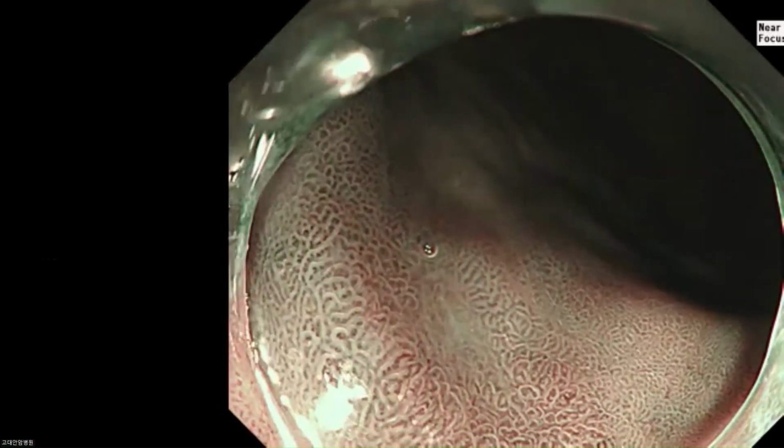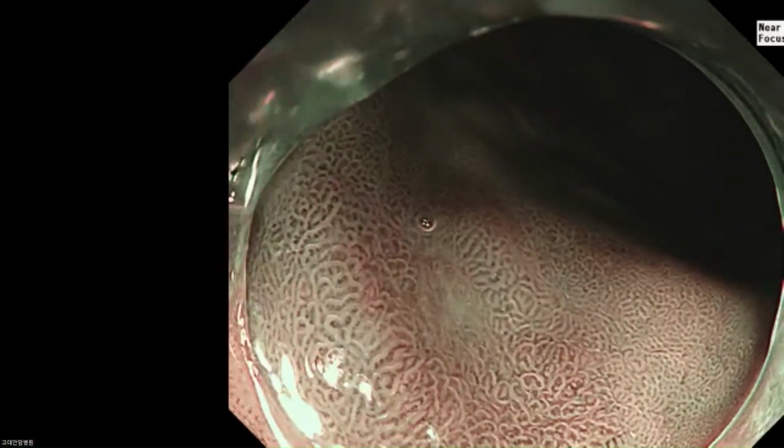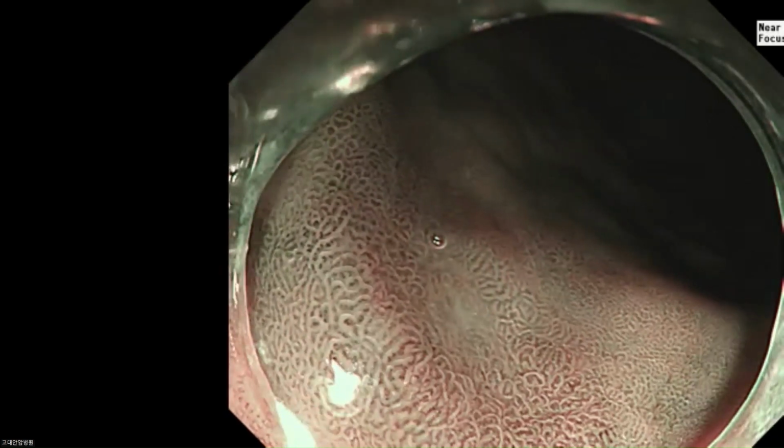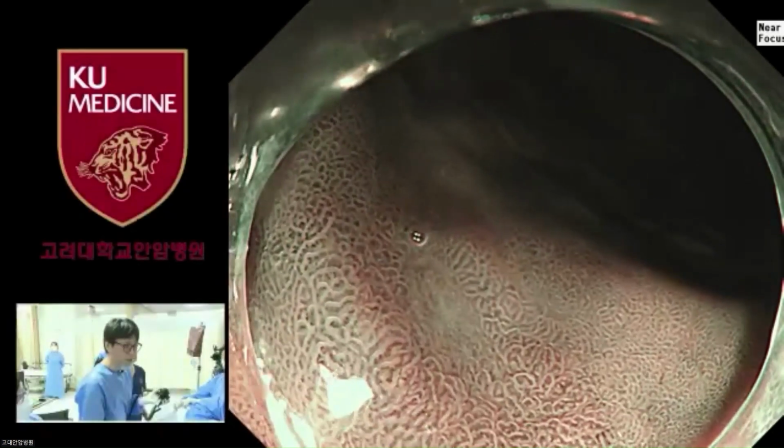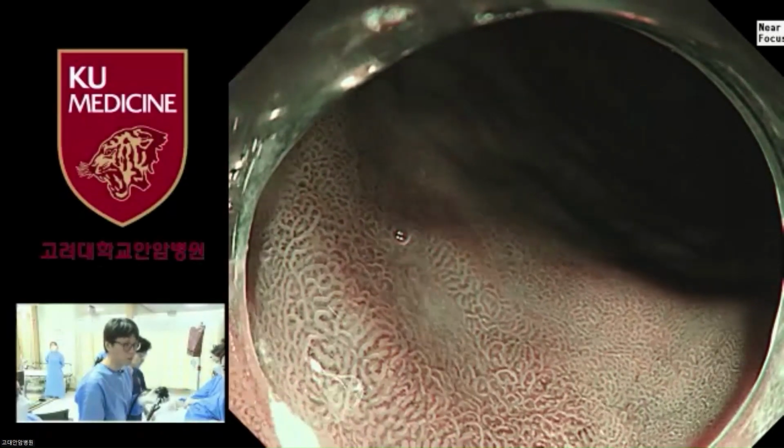In near focus NBI view, the brown colored line is the subepithelial capillary network, and the white line is the marginal crypt epithelium.